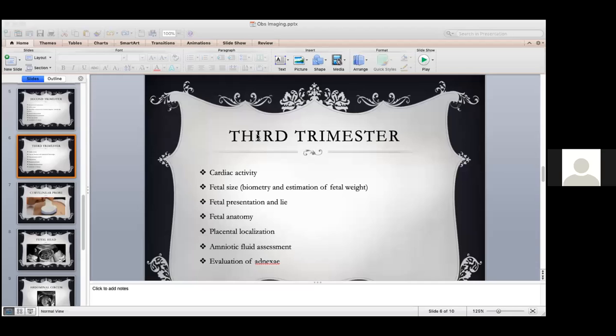I think 8 to 25. I would say also 5 to 25 centimeters. Okay, so both figures are acceptable. However, in radiology, between 5 to 8, we normally say that is mild oligohydramnios. So we want to watch out for that patient who has 5 to 8. So we consider 8 to 25 normal.